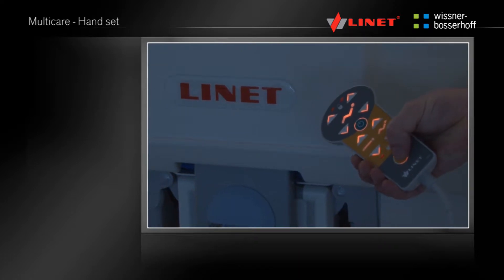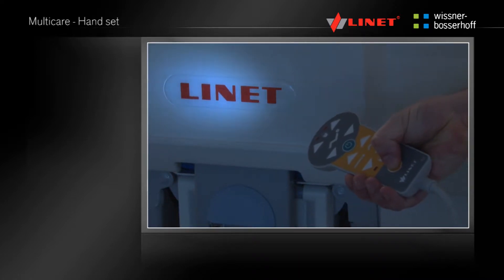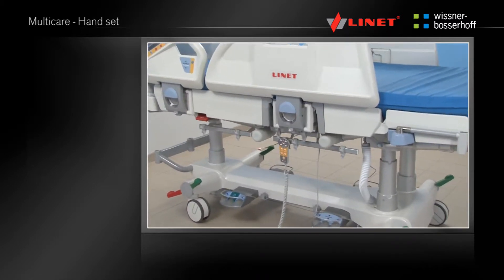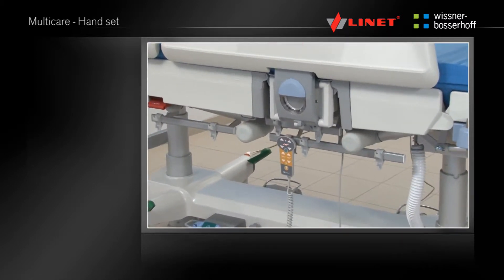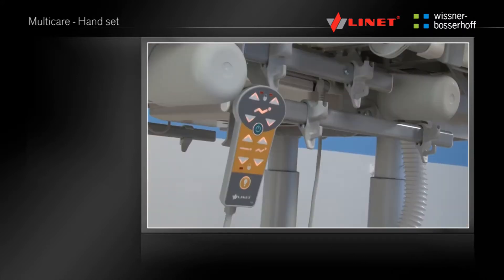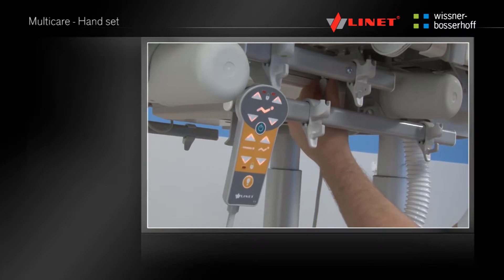The handset has a light for the patient, which can also be used as an examination light. If required, the handset can be removed from the bed by pulling the plug out from the plug-and-play connector. Put a cover over the connector after disconnecting the plug.